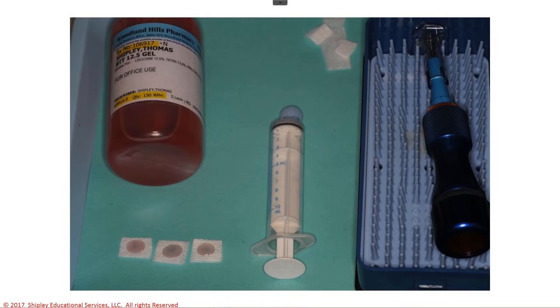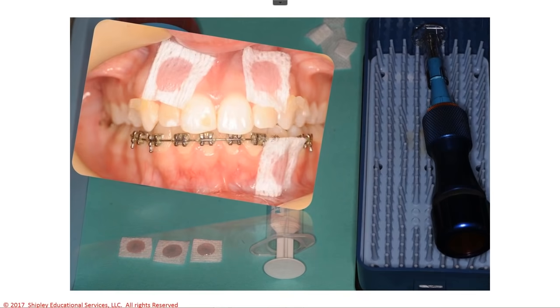We're getting good anesthesia, but we might hit a spot on the patient to where they feel it a little bit. Well, we're going to immediately stop in that area, and we're going to have some of these little tiny pieces of gauze pre-made, so as we're doing the mops, if we have an area where we didn't get good anesthesia, we're going to immediately stop the mops in that area, place this little patch over top of it, continue on to another area to do more mops. 3 minutes later, we'll wipe that off and come back and redo the propel in that area, and on that second go, the patient's going to be plenty numb, and that's what that would look like when we go back and do the retreat if we didn't get good anesthesia the first go around.